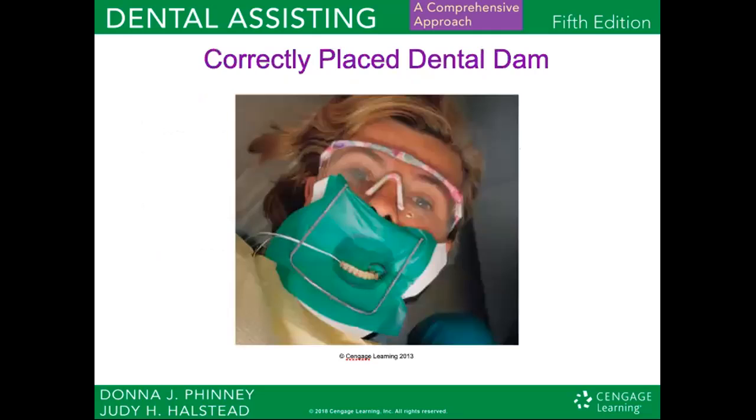So after everything is put together, your patient will look like this. I know they look very comfortable, as comfortable as can be. But you see how the teeth that we're working on here are isolated from any saliva or any blood, and the tongue is kept out of the way. And also everything is covered, so in case you drop an instrument, it won't go down the patient's throat.